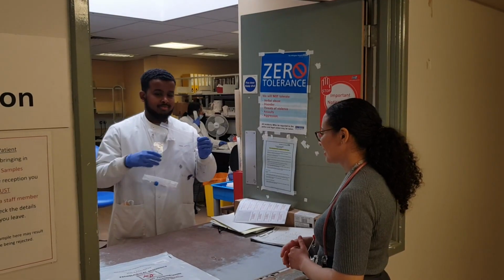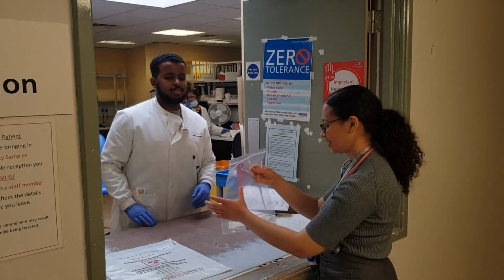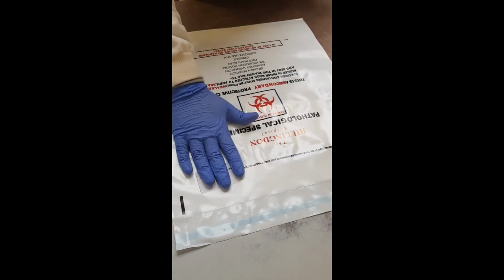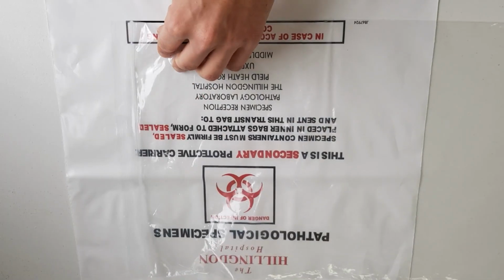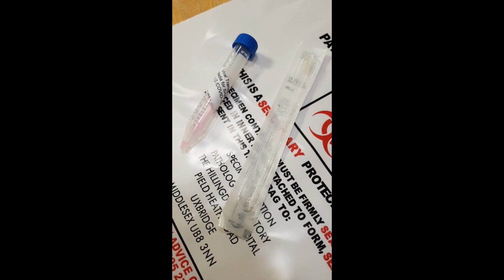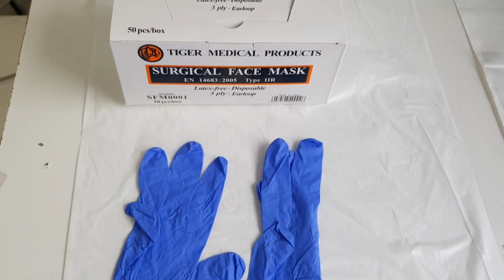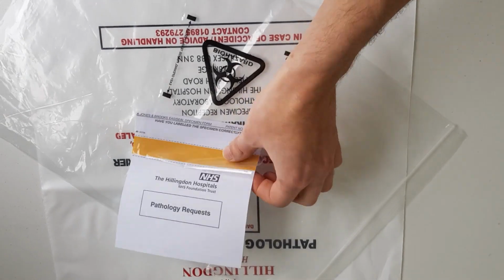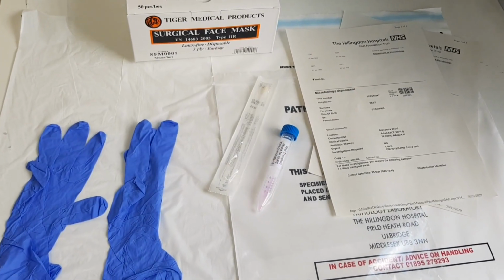To begin, collect the required kit from pathology specimen reception located on the first floor. This includes a white biohazard bag, a transparent resealable bag, a blue capped tube, and a swab. You will also need personal protective equipment or PPE, a regular pathology specimen bag, and 2 copies of the request form.